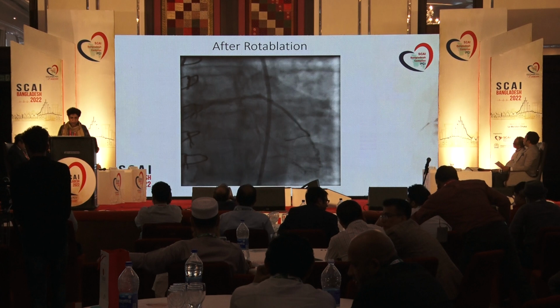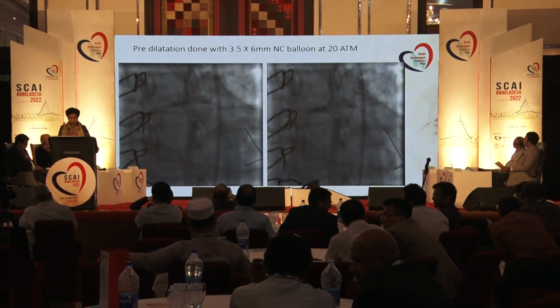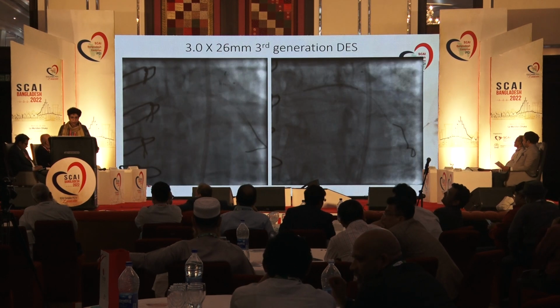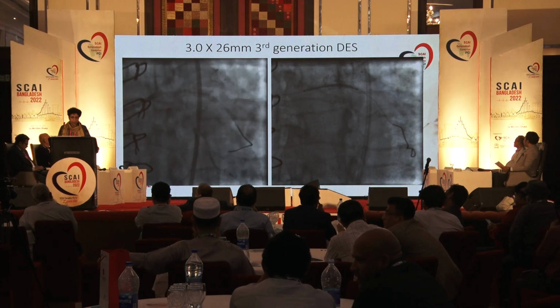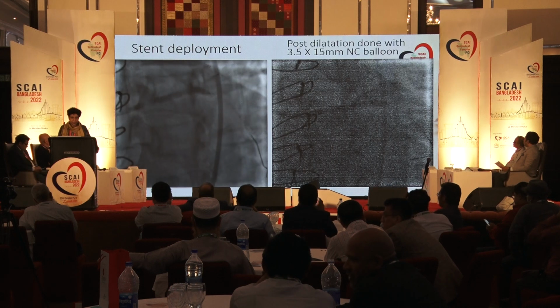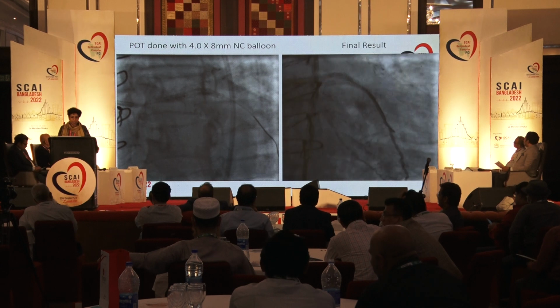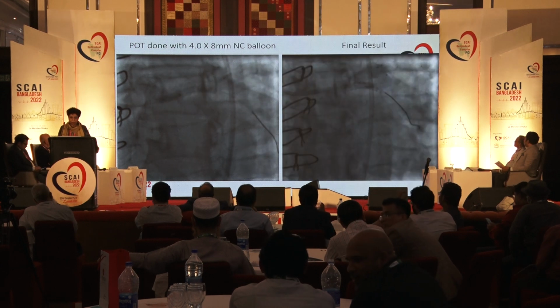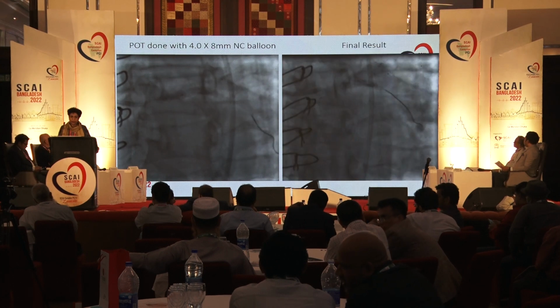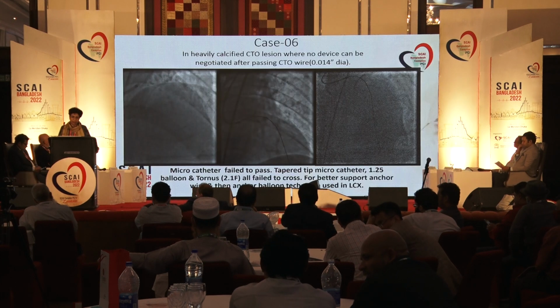After that, we did a thorough job of pre-dilatation, first with a 3.5 NC balloon, and we went up to high pressure. Only then did we take our stent, we deployed it, did post-dilatation, we did POT optimization with the 4 by 8 NC balloon, and this was the final result. So preparing a calcified lesion is crucial before deciding to put in a stent here.